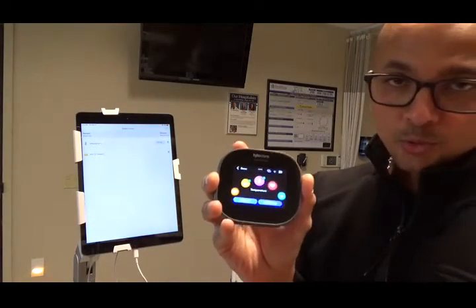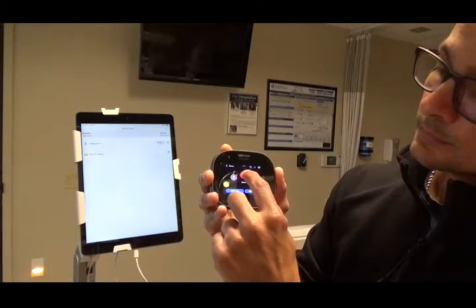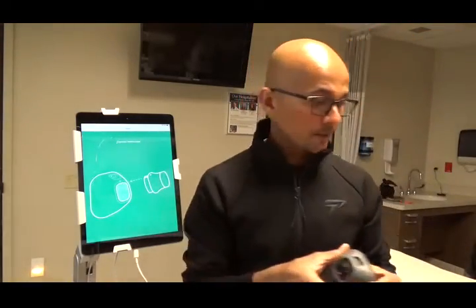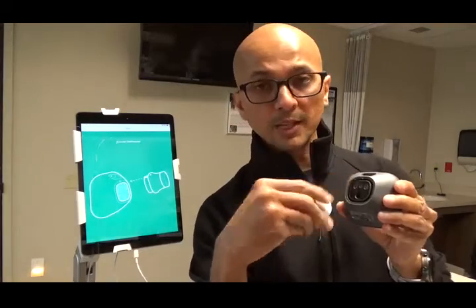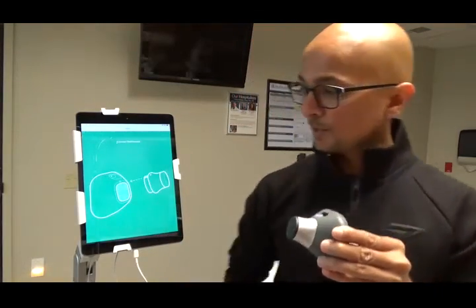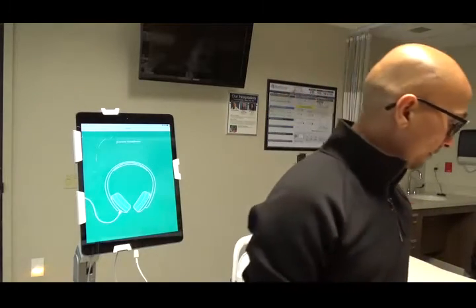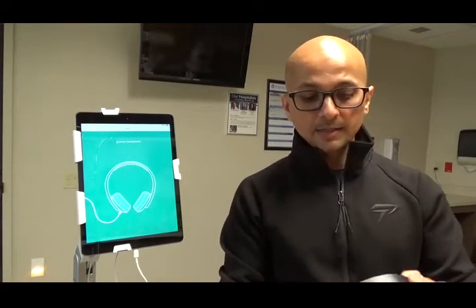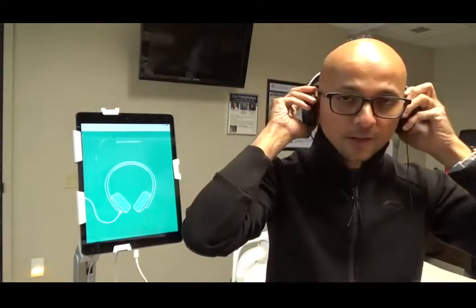Now we could go to the auscultation part. So it'll tell you what to do. Connect the stethoscope. Blue dot here, blue dot here. Okay. Now, given that you're doing the exam, on the live clinician side, they were listening. In this case, you will be listening. So put on your headphones.